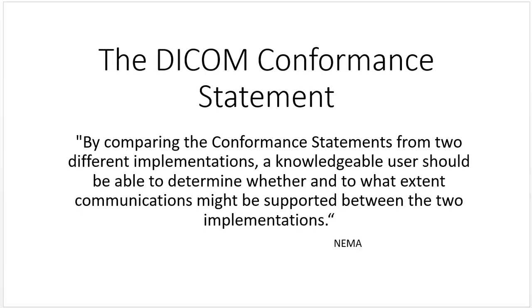Okay, let's talk about the DICOM conformance statement. By comparing the conformance statements from two different implementations, a knowledgeable user should be able to determine whether and to what extent communications might be supported between the two implementations, according to NEMA.